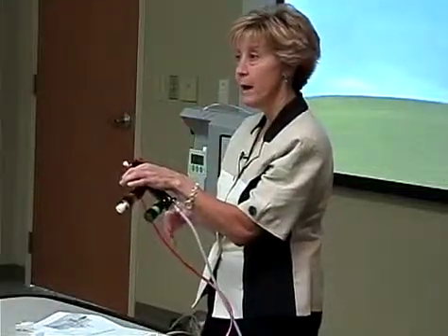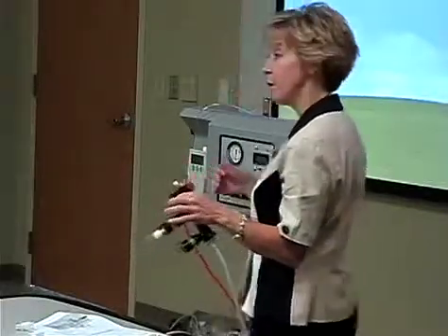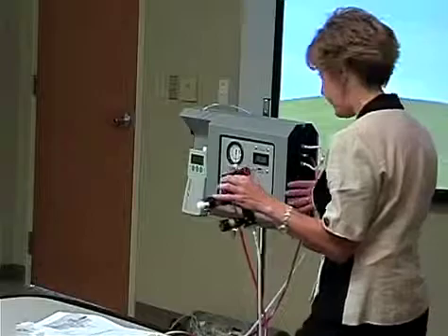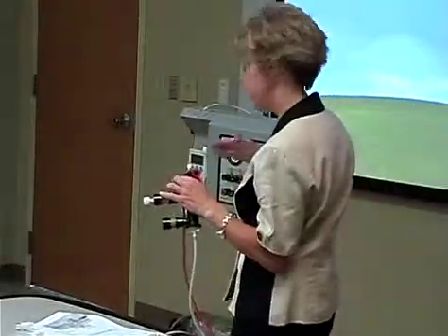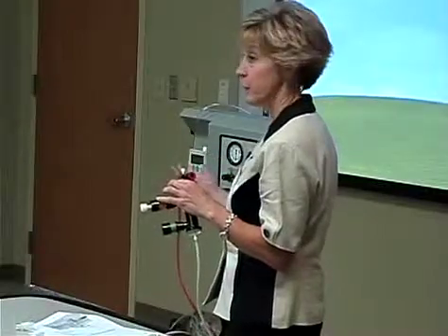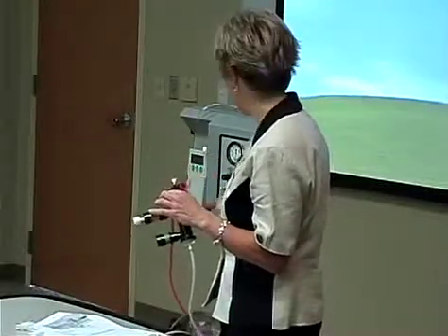We always make note, because we're doing a study of what time we go on high frequency. We put the baby on, and immediately, if you're away from the baby, if I can't see this, then I have my partner say, how's my wiggle? And they'll say, yeah, I need a little bit more wiggle. And then we adjust this.